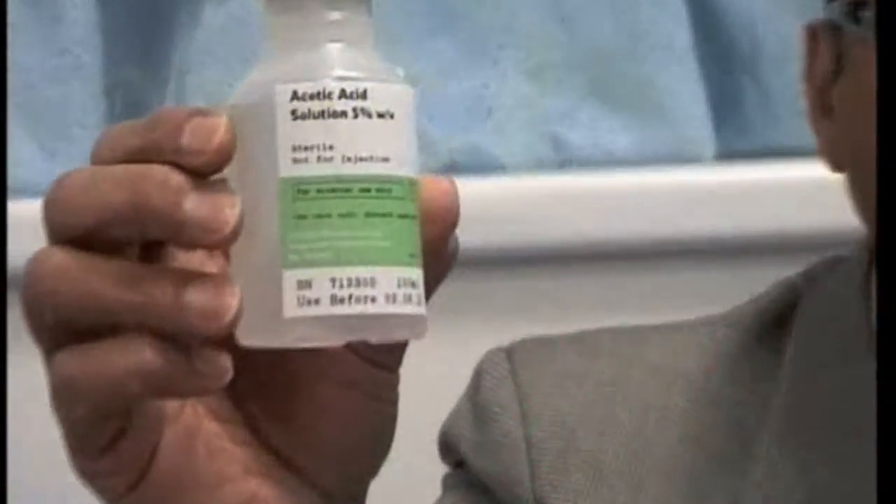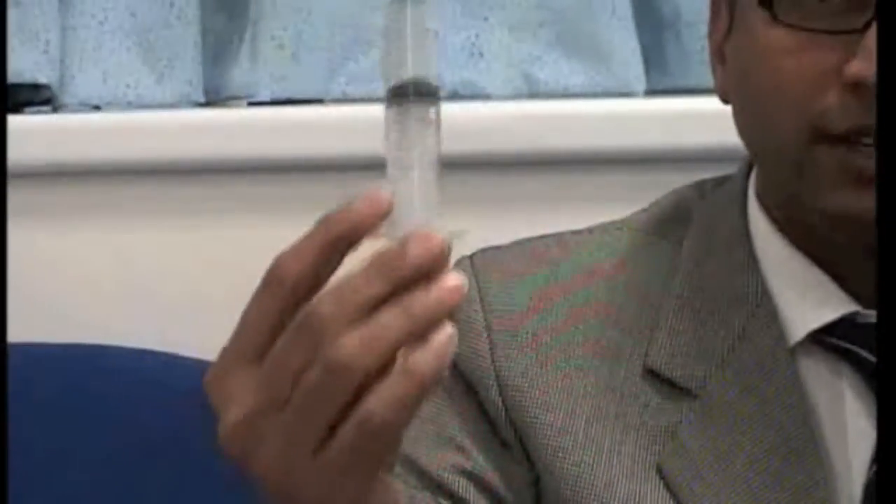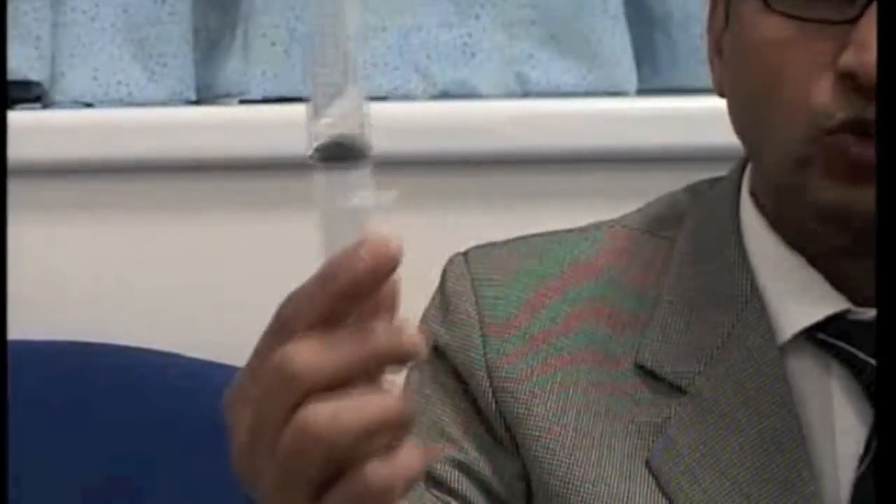In the early stages when I started using acetic acid, I played around with various strengths of acetic acid but ultimately figured out that the best strength for Barrett's esophagus is 2.5%. Acetic acid is commercially available at 5% strength, as you can see on this bottle. In order to achieve the correct strength, we load 10 ml of acetic acid and dilute it up to 20 ml using normal saline. That effectively gives us 2.5% of acetic acid.